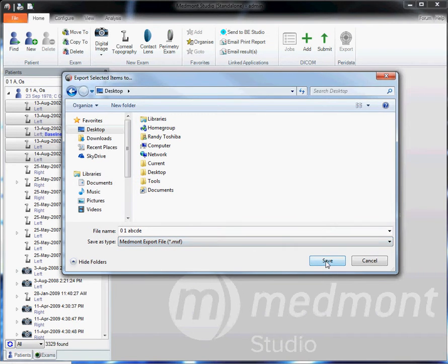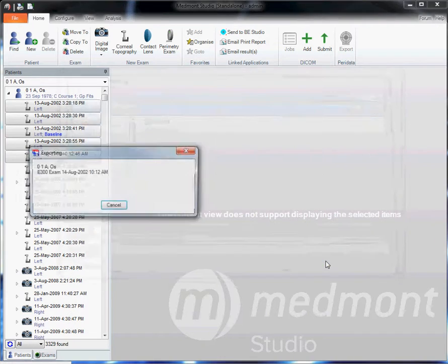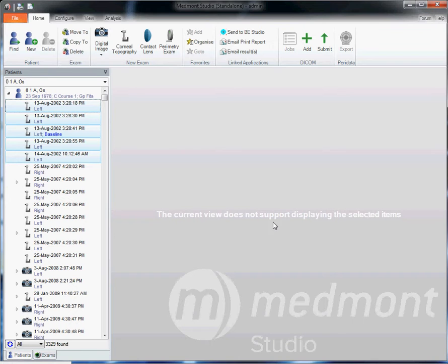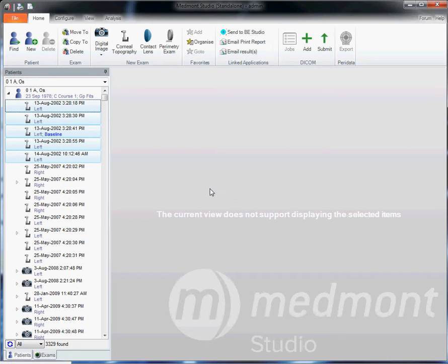When you're satisfied, click save. Then go to your email software, attach that export file and email it off. And your recipient, if they have the Medmont software running, can import and open up those patient files and have the full analysis functionality that you have from your Medmont.